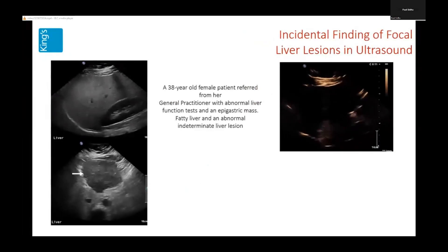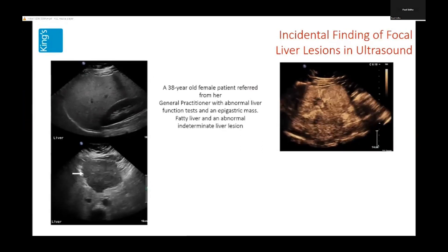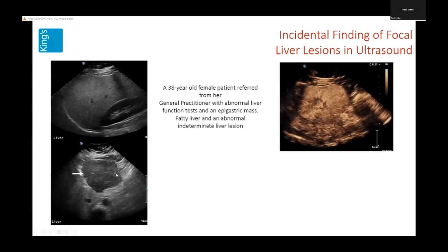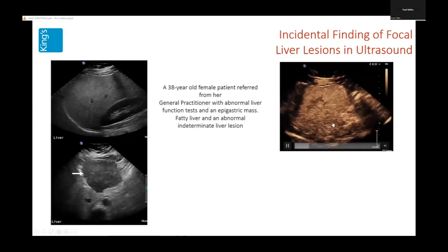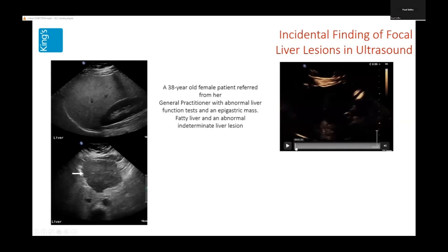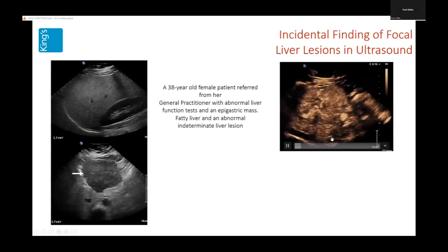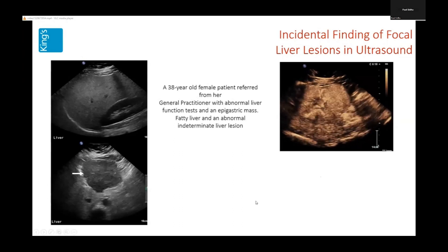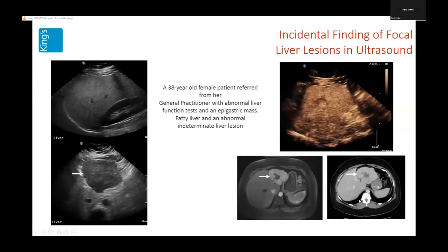Here's a great example: a 38-year-old lady referred from the GP with a fatty liver and a large palpable mass in the epigastrium of low reflectivity. On contrast-enhanced ultrasound administered on the day she attended, there is a hyper-enhancing lesion with a focal scar in the middle. Most importantly, as the examination starts and you watch the contrast come in, there is that spoke-wheel pattern of a focal nodular hyperplasia. The clinicians went on to MR and CT, which of course confirmed exactly what had been seen on CEUS.